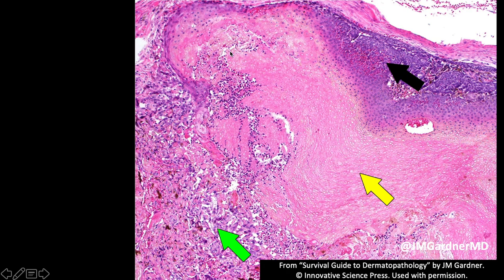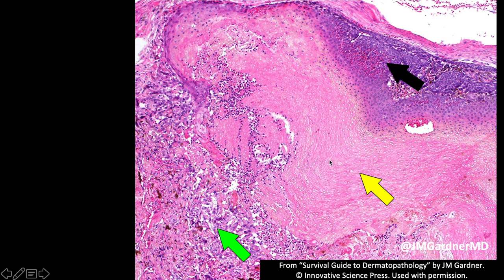Mitoses are often abundant in pilomatrichoma and do not worry me for malignancy unless there is severe nuclear atypia or atypical mitotic figures. The amounts of the three components — basaloid cells, ghost cells, and giant cell reaction — can vary widely. Sometimes abundant blue basaloid cells dominate and scare people. Other cases are just ghost shadow cells with giant cell reaction, calcification, or even ossification, with no basaloid cells at all. These are more common in children but can occur in elderly adults as well.